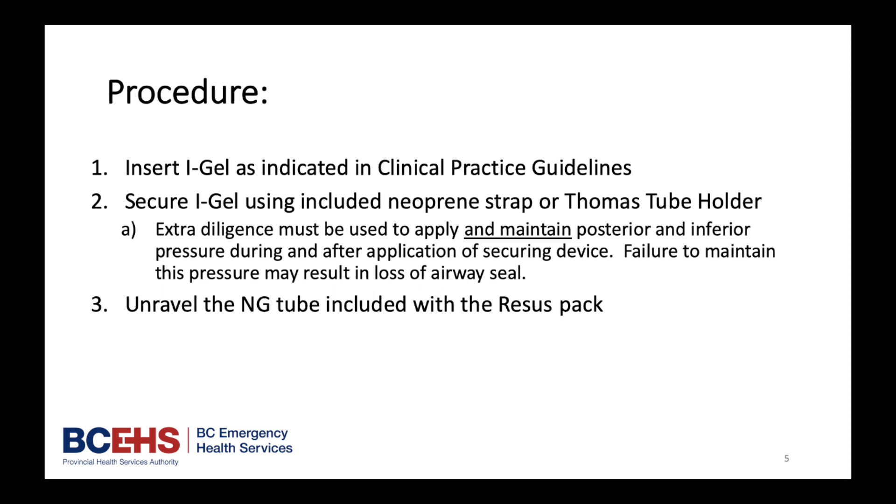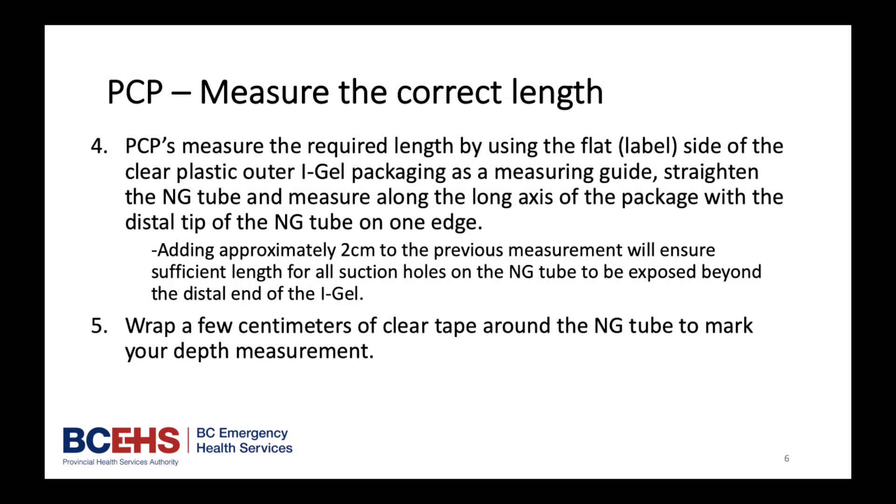Unravel the NG tube included with the Resus pack. PCPs will measure the required length by using the flat, labeled side of the clear plastic outer iGel packaging as a measuring guide. Straighten the NG tube and measure along the long axis of the package with the distal tip of the NG tube on one edge. Adding approximately 2 cm to the previous measurement will ensure sufficient length for all suction holes on the NG tube to be exposed beyond the distal end of the iGel. Wrap a few cm of clear tape around the NG tube to mark your depth measurement.